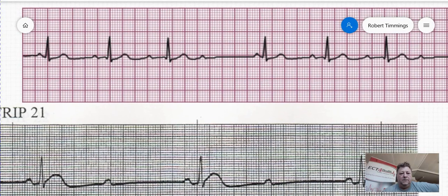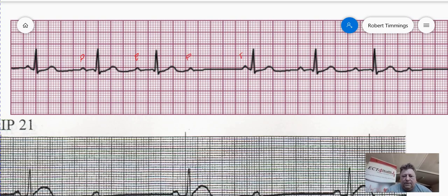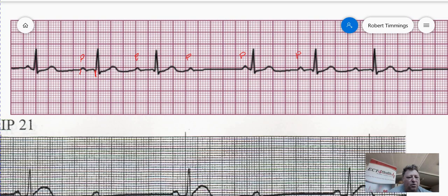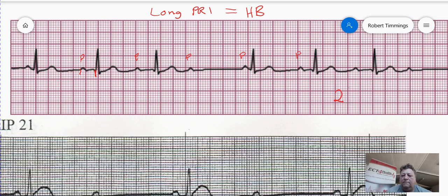Let's have a look at a couple of others. Looking at this top strip, we can see another rhythm — these are all lead 2 strips. We can see P waves here, and we can measure the PR interval. Going from the very beginning of the PR interval to the very end, we've got almost 7 boxes. So we've got a long PR interval — that's the first criteria, which automatically diagnoses it as a heart block. This is a second degree heart block, and there are two types: second degree type 1 and second degree type 2.